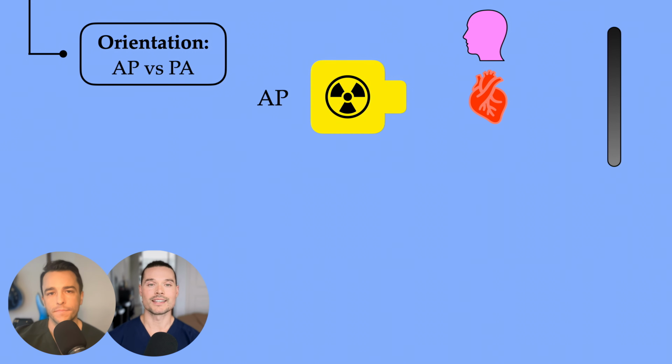So this is a coronal. Coronal means crown, which is coming straight down the patient. So think of this as you are looking straight at the patient and they are staring right back at you. The patient's right is on the left of your screen and the patient's left is on the right of your screen. And again, this is anatomical position. Up top is cephalad, towards the head, and down below is caudad, towards the feet.